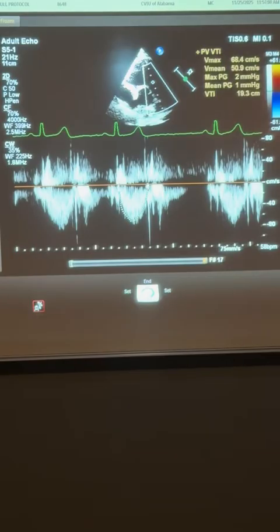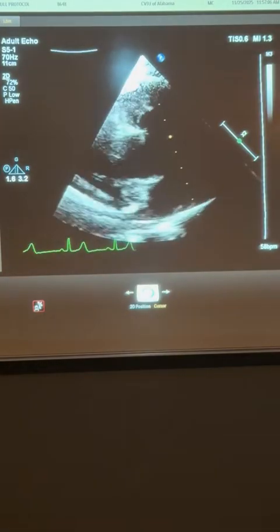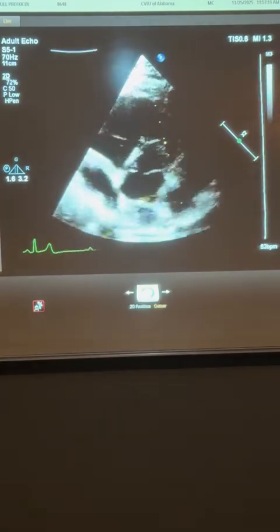I'm always hugging the chin, not the beard, when it comes to measurements, to make sure that I'm not overdoing it. I'm not sure if I can get her PR here. I don't really see it, but if we did, we would obtain the PR end again.